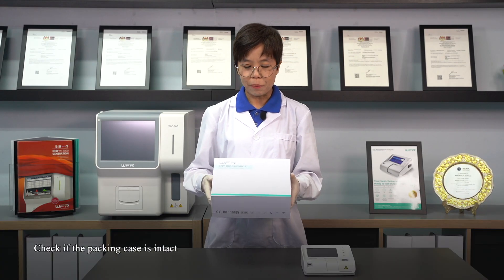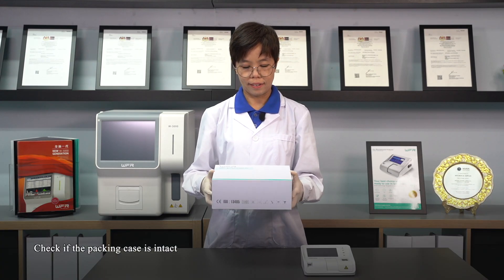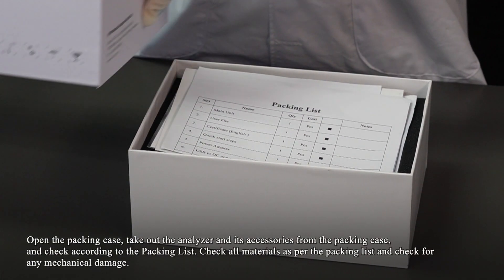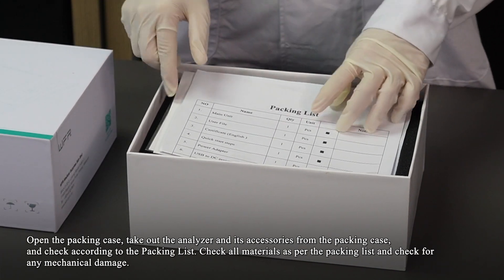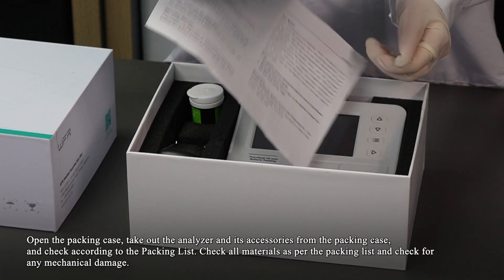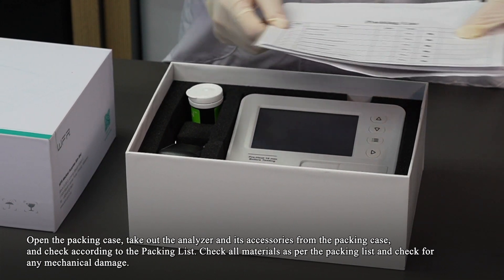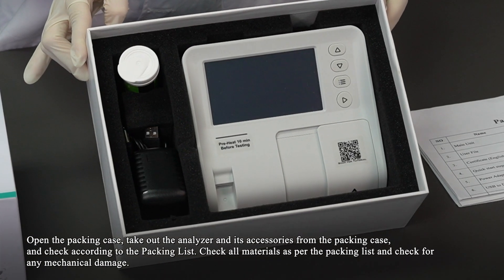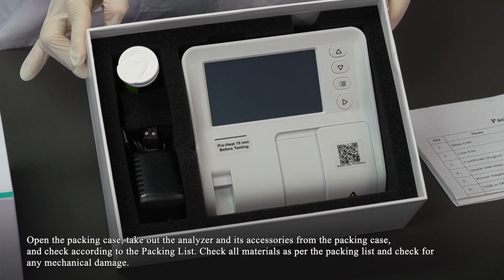Check if the packing case is intact. Open the packing case. Take out the analyzer and its accessories from the packing case and check according to the packing list. Check all materials as per the packing list and check for any mechanical damage.